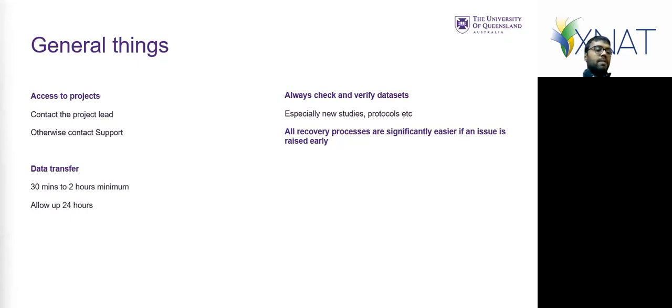It can sometimes take a bit longer, so just allow about 24 hours for transfer, but after that, it's likely that something's stalled on the chain, so just contact your facility or support. Always try and check and verify your data sets, especially if it involves new studies and protocols.